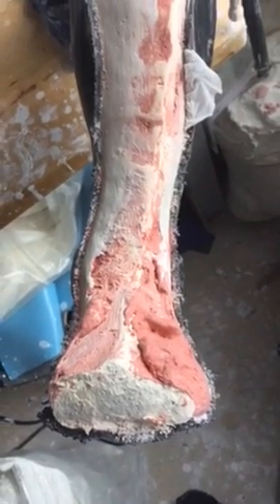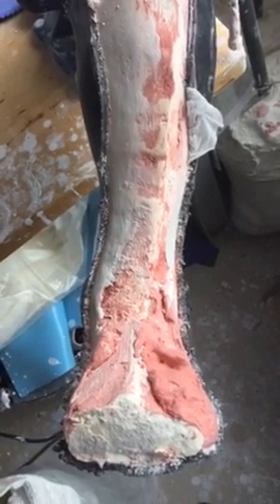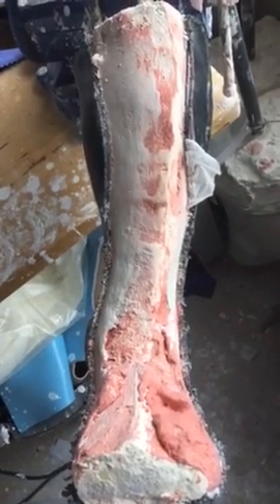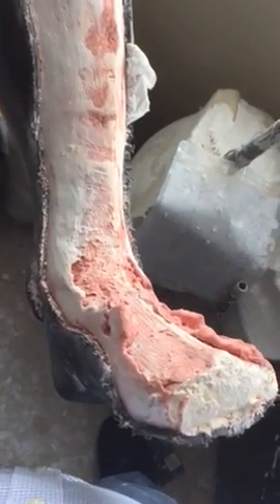All of this white and red that you are seeing is actually plaster of Paris — some just has chalk added to it and some doesn't. As you can see, this looks just like a person's leg.